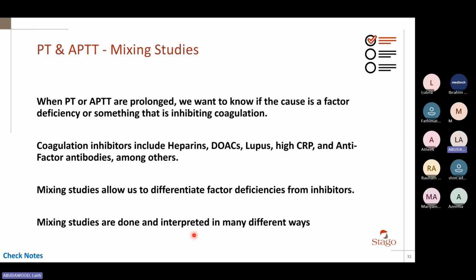So going back to the patient with 0 levels of factor 2, how about if I mix my patient sample with an equal amount of something that I called pooled normal plasma? Pooled normal plasma is a plasma that I pool or collect from many patients. Recommendations are up to 40 normal patients, or people.